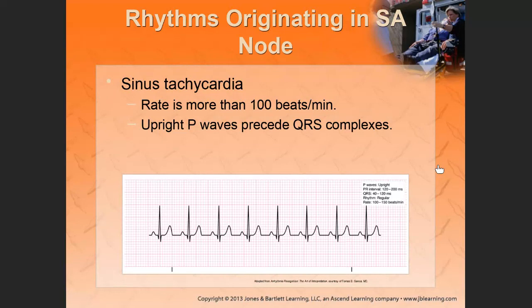Now, is it irregular or regular? You use a paper, Miss Carr? How you know so quick? Hmm? How you know so quick? Gonna use a paper and mark it off?